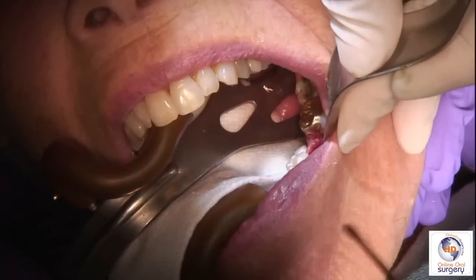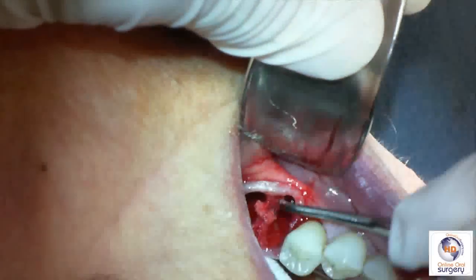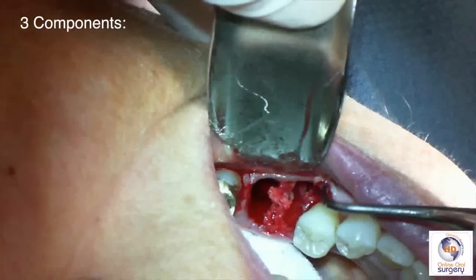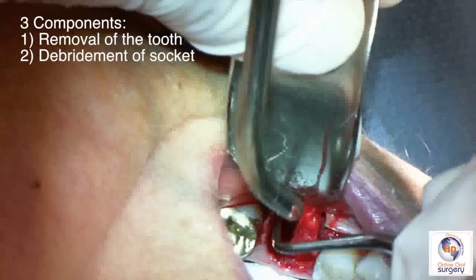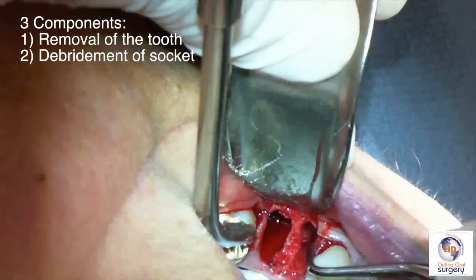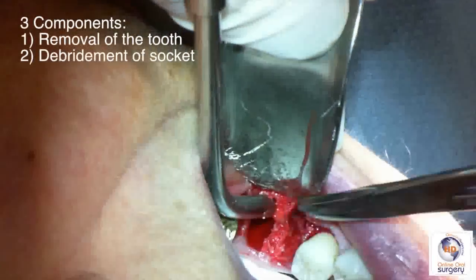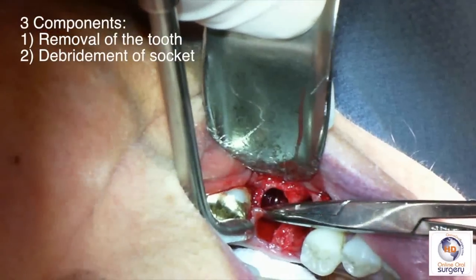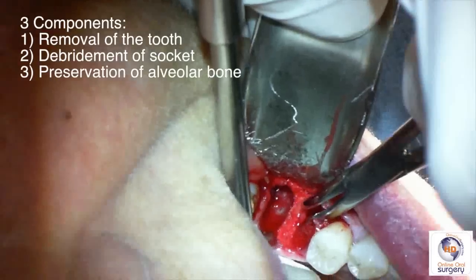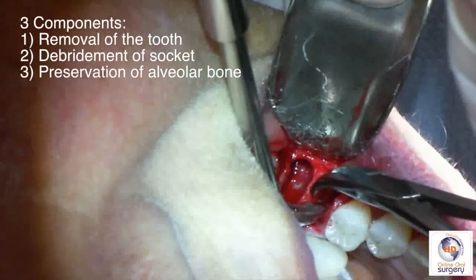Now that the tooth is out, our job is only a third of the way done. I like to think of an extraction as having three components. The first is removal of the tooth itself. The second is to thoroughly debride the socket of all granulation tissue, infected tissue, and any debris that can interfere with healing or may serve as a nidus of infection. The third part of the procedure is to prepare the socket for the eventual implant — that's the ridge preservation graft, which we'll do next.